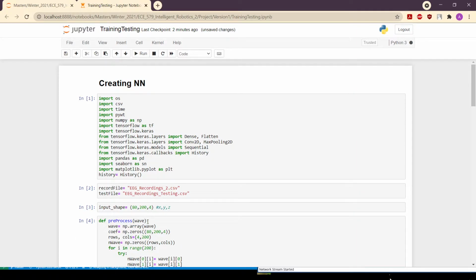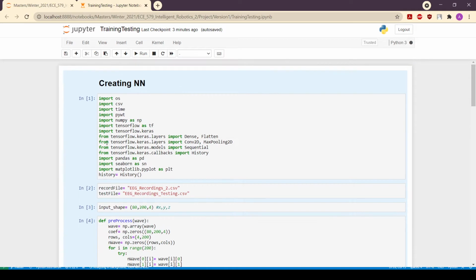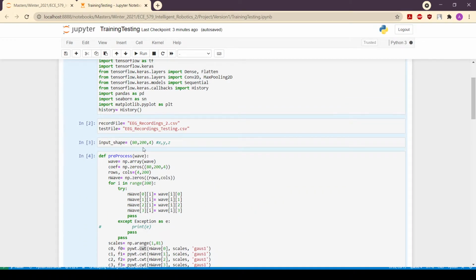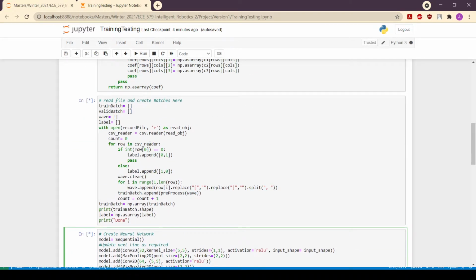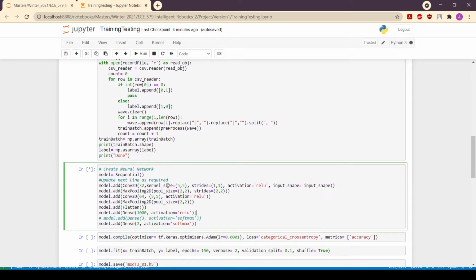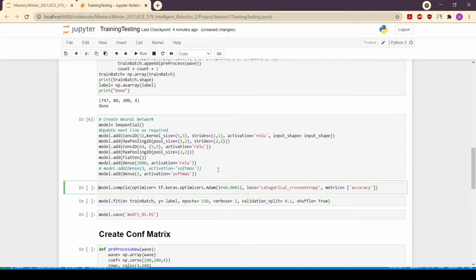As said again, the 2 seconds here, 200 just denotes 200 two-second snaps, and it is currently creating those test batches. And here I create a convolutional neural network of that input size with two convolutional layers and two dense layers, with the first dense layer of 1000 neurons and the second dense layer with an output of 2 neurons. So once this is created, we compile it, train it with the training set, and save the model.